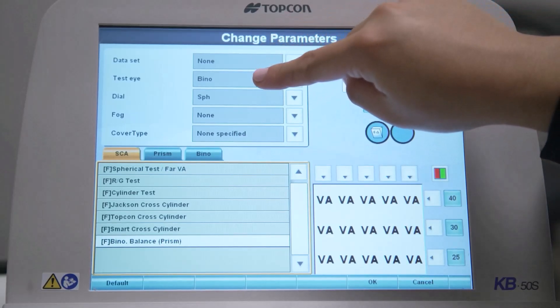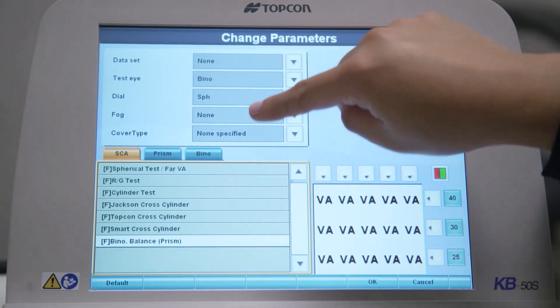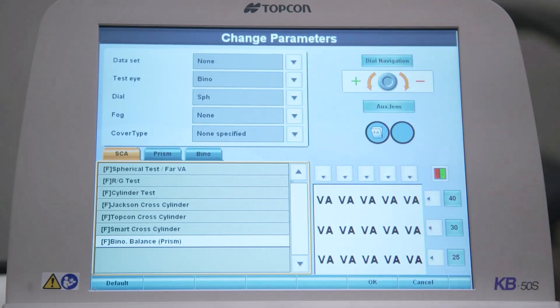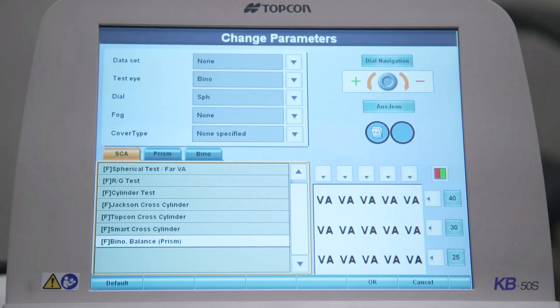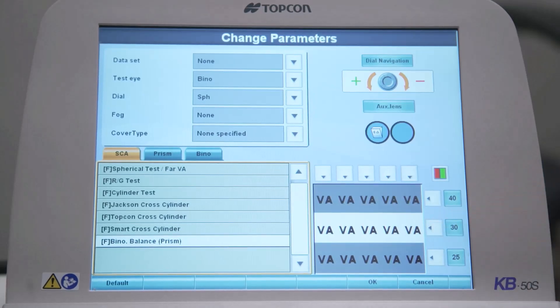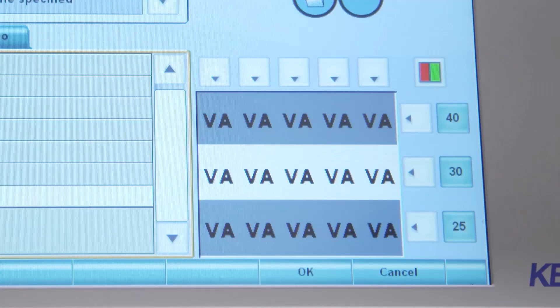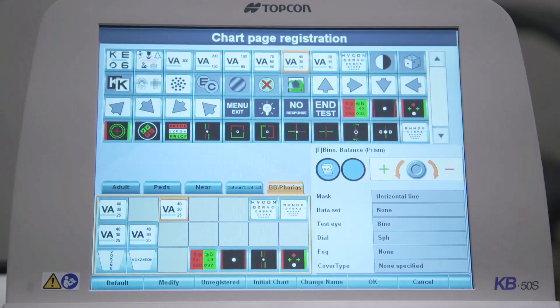Now, when this chart is selected from the main menu during a refraction, a lens with six base up prism will automatically load in front of the patient's right eye. This modification can be seen on the right side under auxiliary lens. You can also customize whether the whole chart or just part of the chart is displayed. Touch the arrow next to one of the visual acuity lines to select a single line — this is the line that the patient will see during this customized chart test. Select the OK button at the bottom of the screen to return to the previous screen.